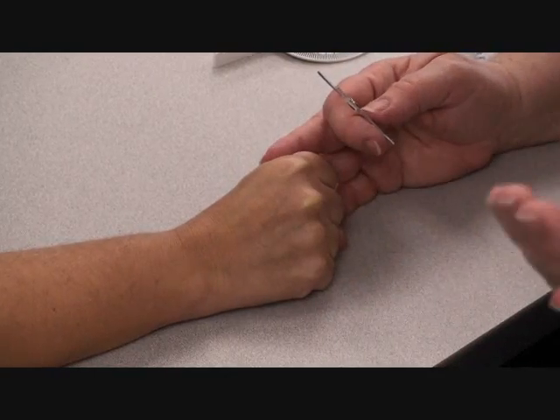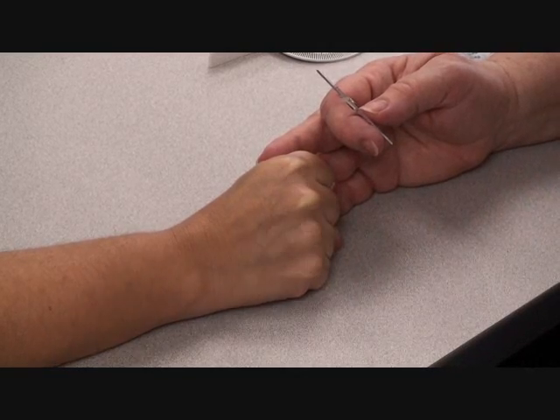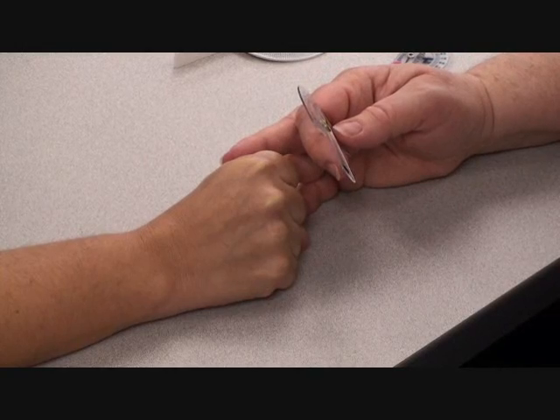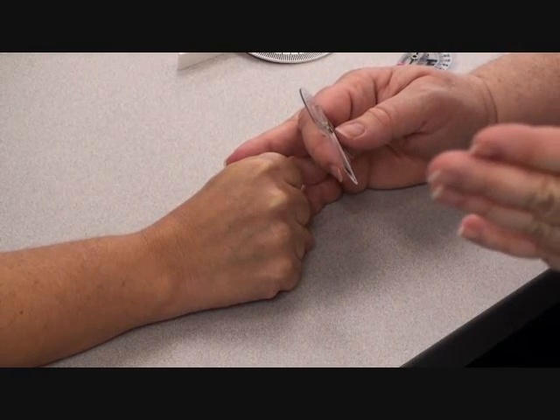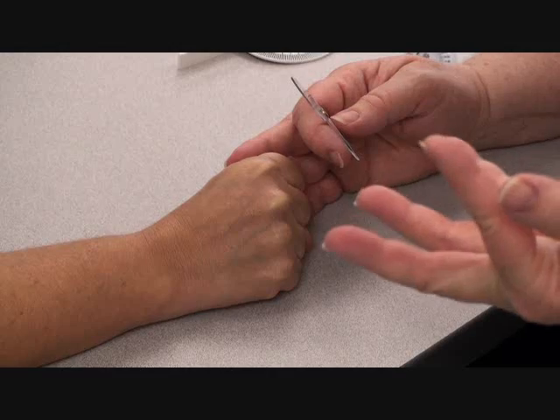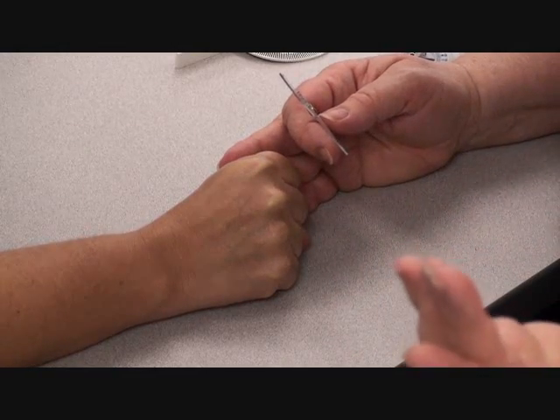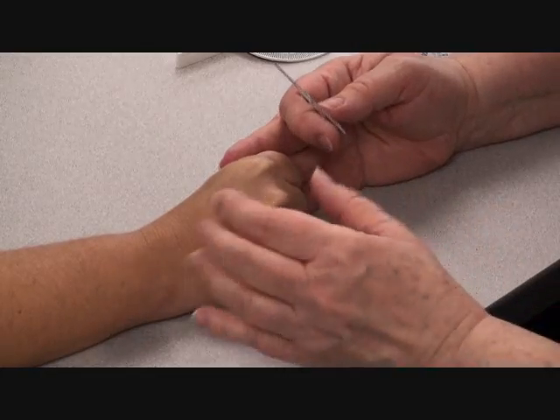Not unless it's comparing. So you have one hand that's injured and has severely limited range of motion. You measure the other hand so that you'll have your comparison, right? But if people have full range of motion in both their hands, then we would just say they have full range of motion in their digits.